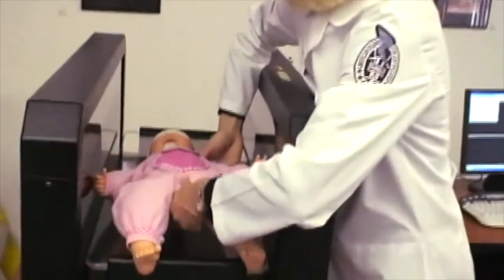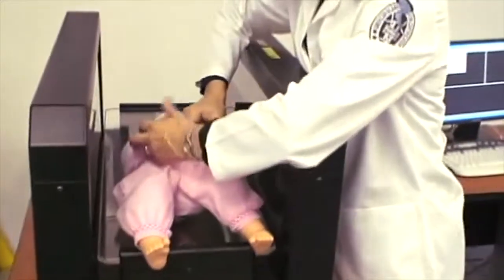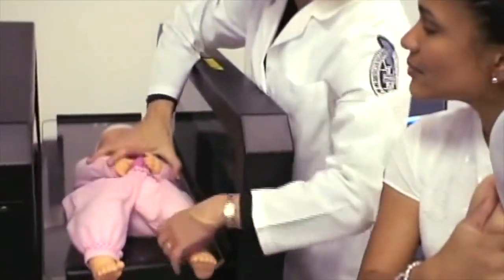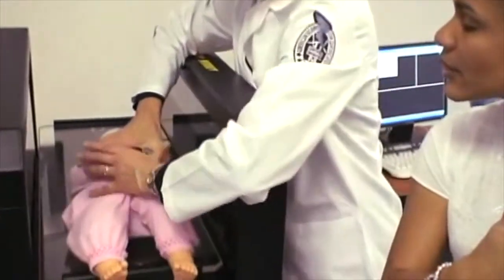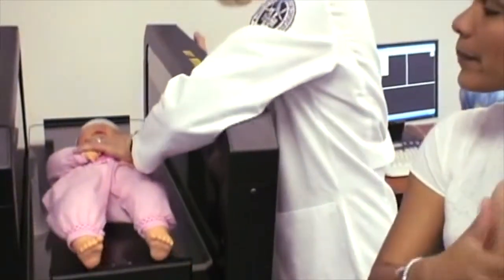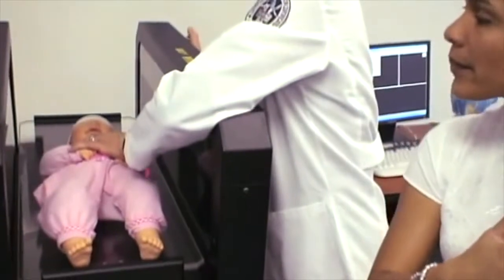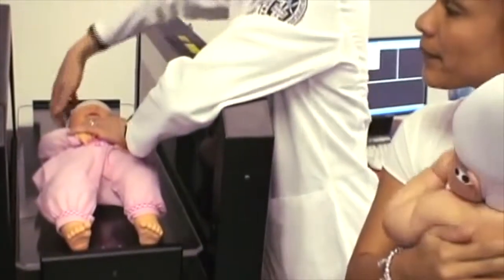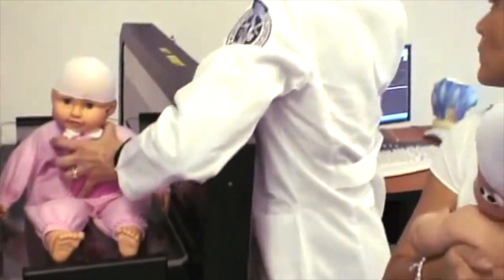I'm going to show you how to lay her in and I'll ask you to hold her. You can stand a little bit off to the side here. You can hold her arms — make sure she doesn't push off against you. I'm going to hold her chin. Watch now as it moves. And then we'll look at the scan to make sure it looks good.